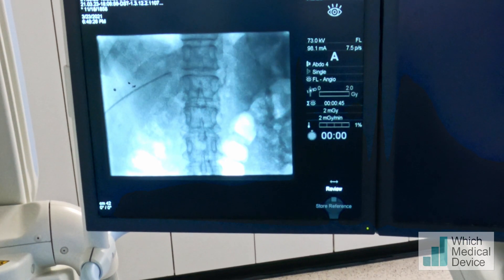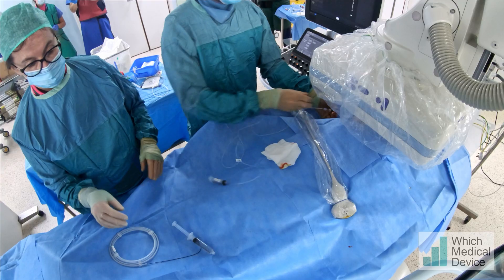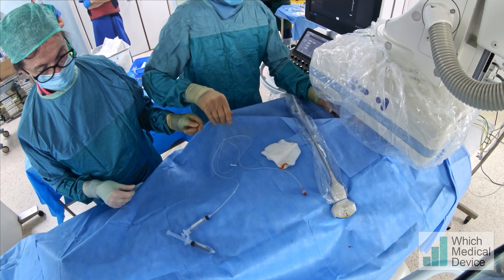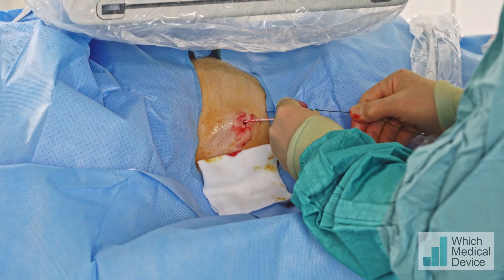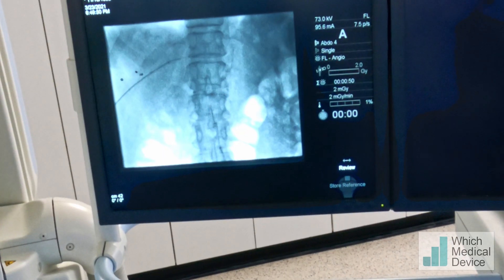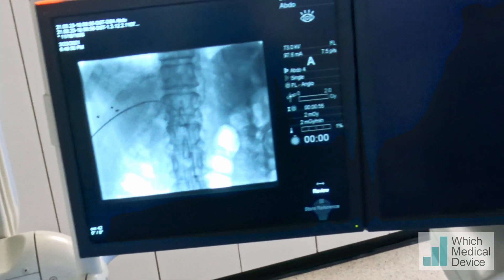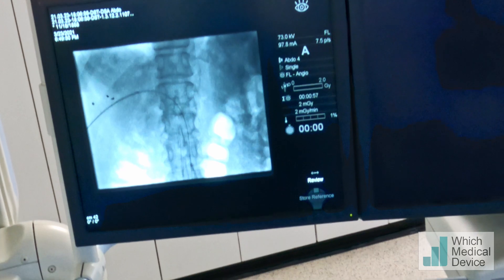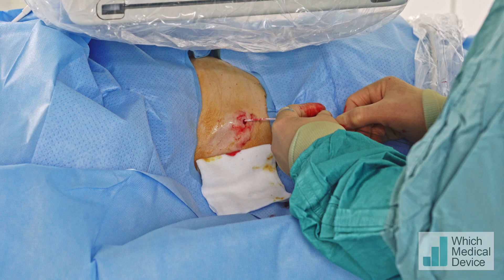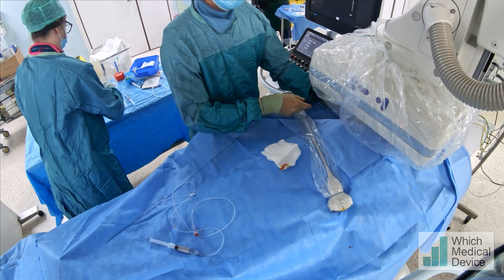We've gone into a little branch there, so we're just going to pull that back. I'll take the Benson wire please, and we'll have that Vector 2 catheter and the slippy wire as well. I'm just advancing the Benson wire in now — actually, we don't need the Vector catheter; the wire's looped over and gone down the portal vein. So we can now advance this down into the main part of the portal vein.